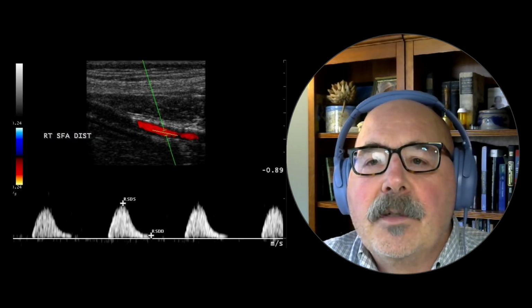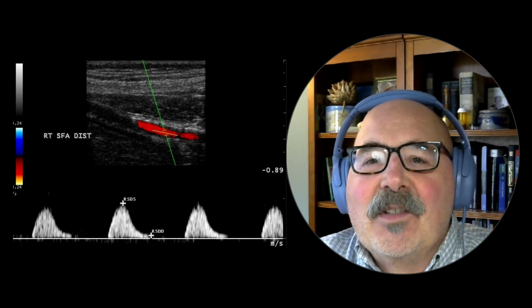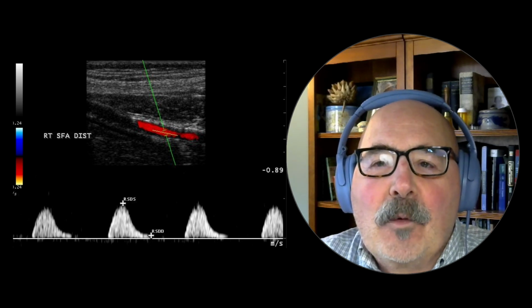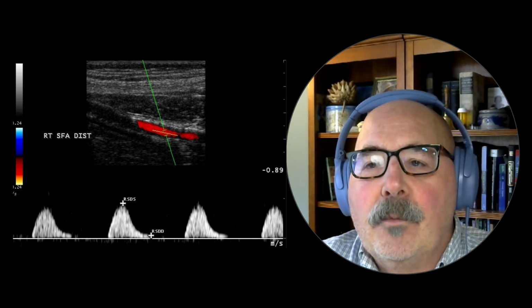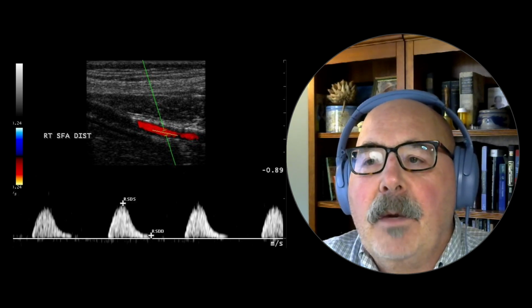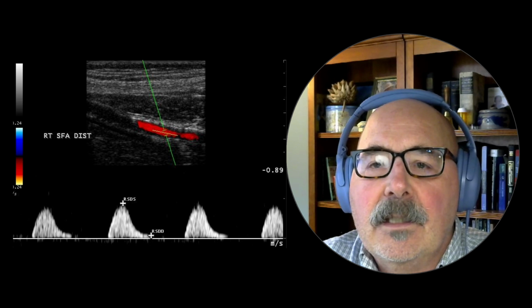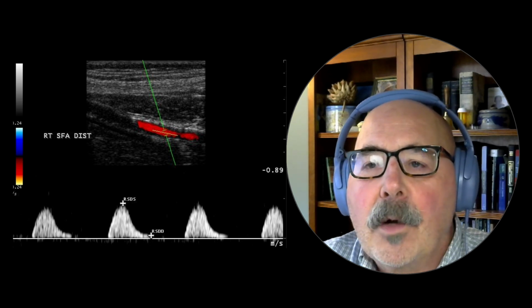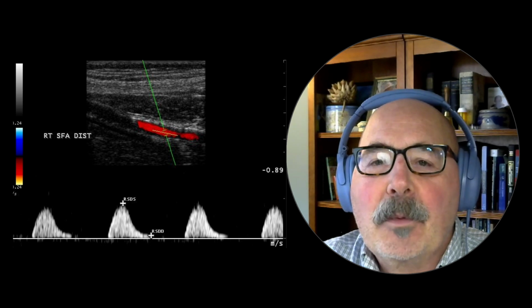While I could spend hours discussing hemodynamics, and I mean hours and hours, I want to emphasize the need for standardization of waveform nomenclature. Arterial spectral Doppler and analog Doppler waveforms should be reported using key major descriptors: the direction of flow, phasicity, and resistance. Modifier terms may be incorporated to provide additional information about waveform appearance.